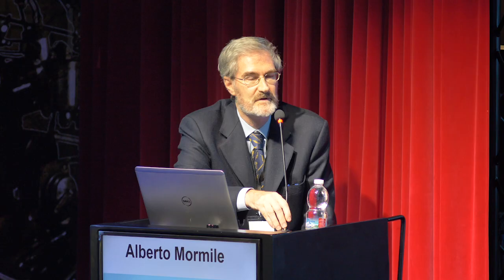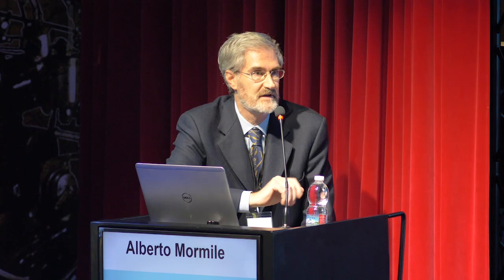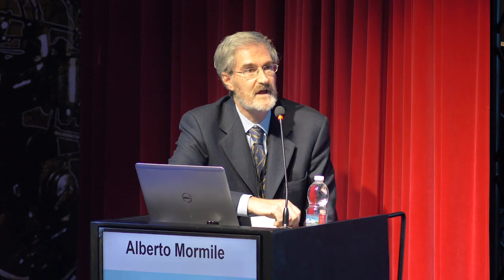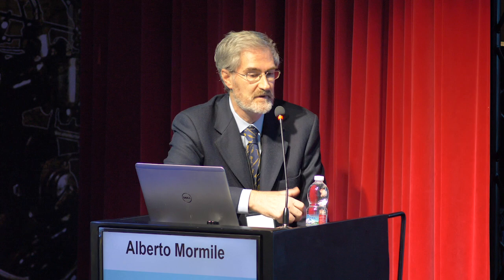Usually, we use the unipolar. Bipolar only in particular cases, of course. Why? Because of the cost of the needle? No, but because it's the standard needle and is always used, and it's very easy to use. And we haven't had complications with the ground pads in our experience.